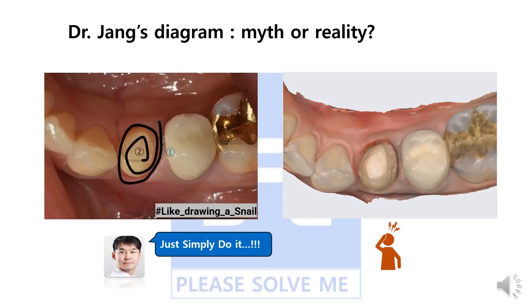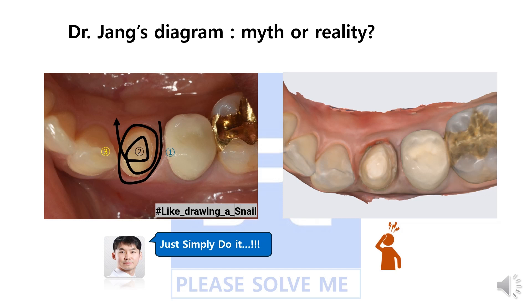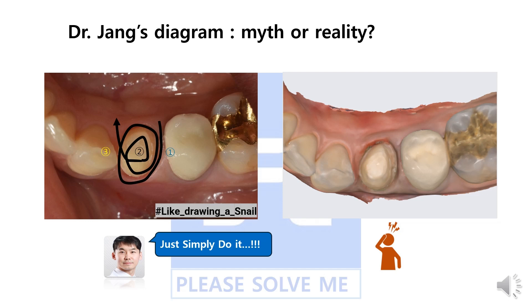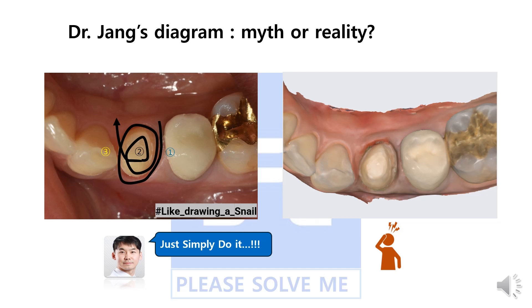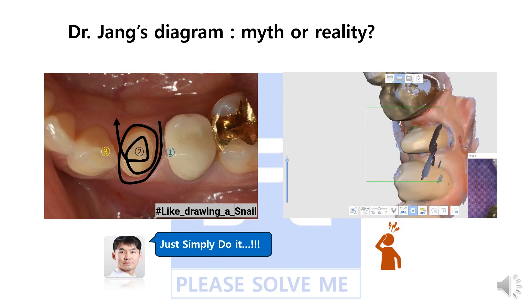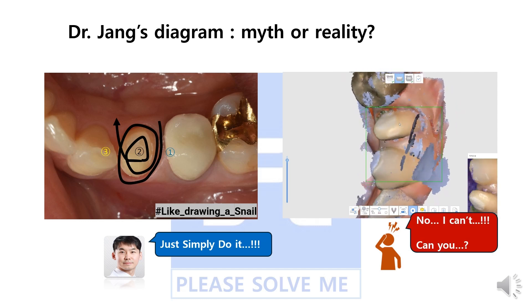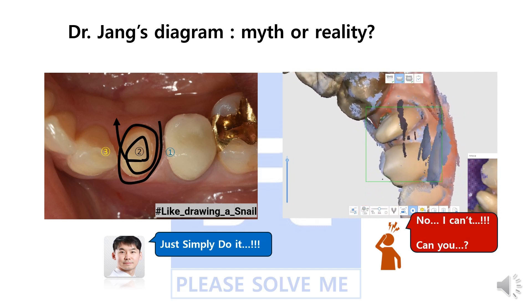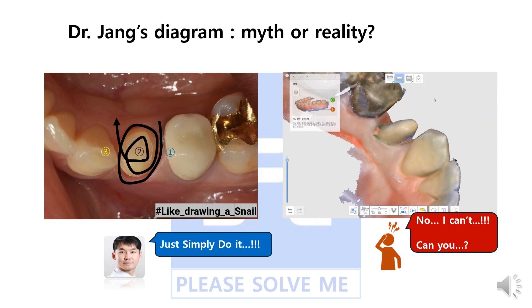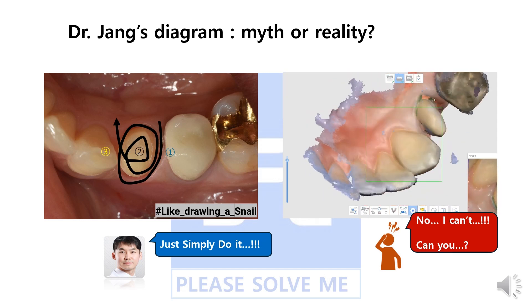This is a sketch I draw for my staff showing the sequence. When I draw this path, I never lift my pen once — it is drawn in one continuous line. In the same way, the entire prepared crown could be obtained with a single uninterrupted motion. There is a lower chance that layering occurs because we scan in a three-dimensional motion, though some points or lines could overlap. In addition, to achieve sufficient data of the green color in the reliability map, a rolling motion is required, but if the motion is excessive, layers may also occur.